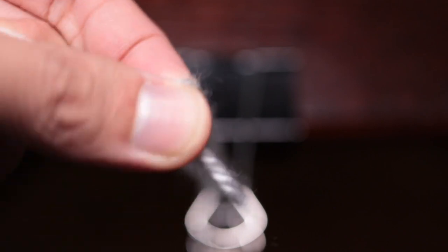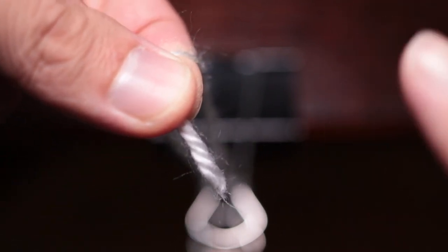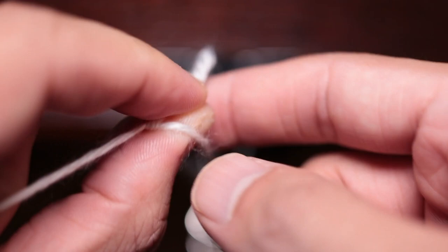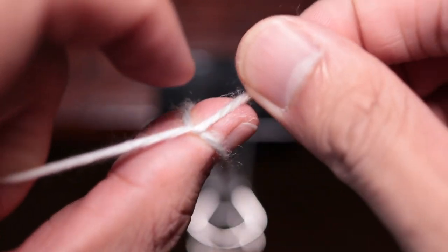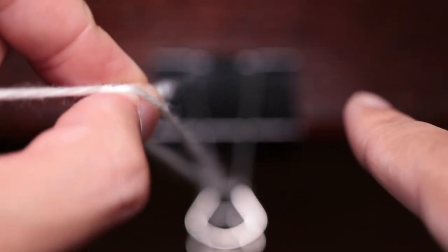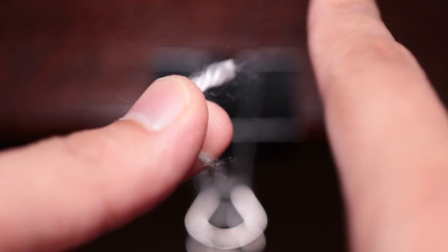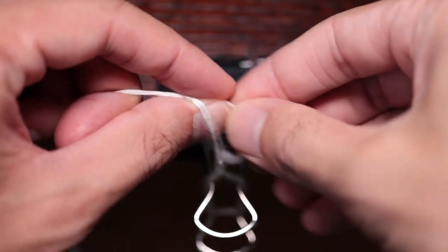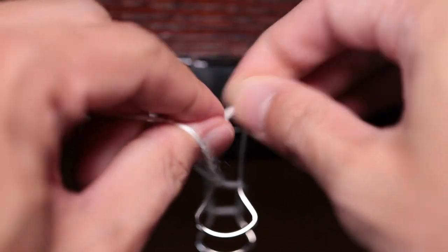Again, it's facing away, so you want to end up making it face away again and not towards. Don't just flip it—make a nice semicircle so that it ends up over there and you know to pull in that direction. And that's it.